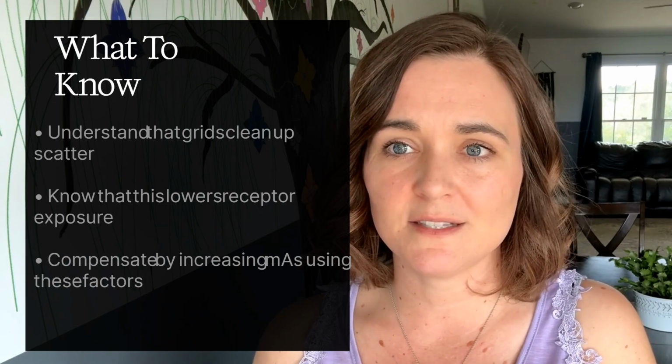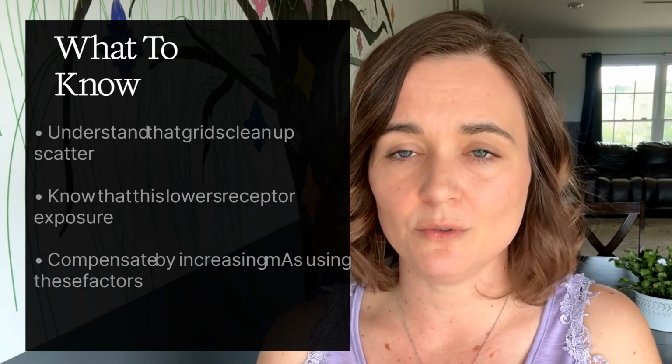Using these factors, this is high yield and absolutely testable. Heads up for test takers. If you're preparing for the full ARRT board exam, you should definitely memorize the most common grid conversion factors. They're fair game for the technique compensation and dose adjustment questions.